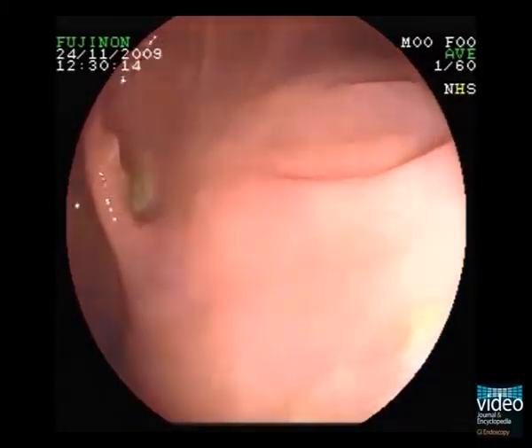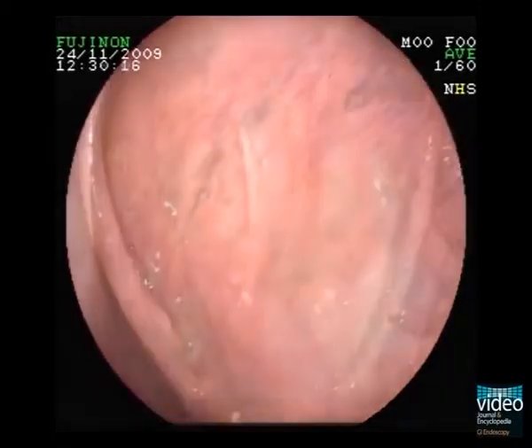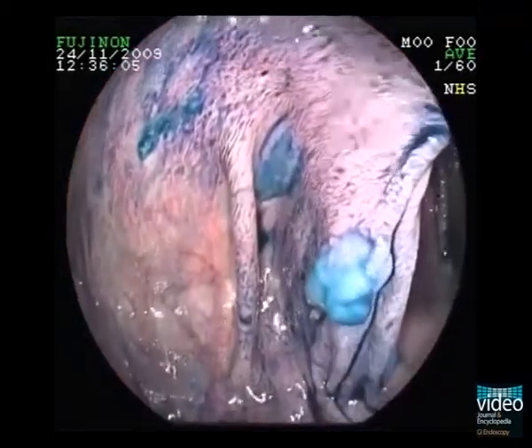Spraying with indigo carmine dramatically improves demarcation of these flat lesions, and now we see many more.